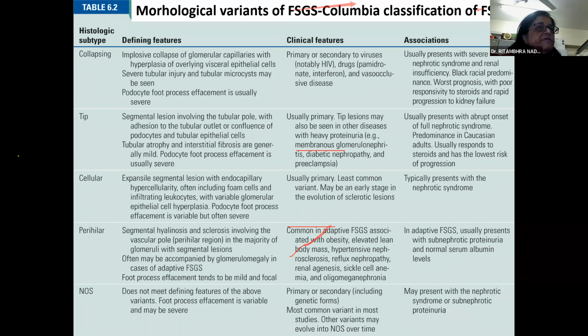So in absence of heavy proteinuria, presence of interstitial foam cells should prompt us to submit the tissue for electron microscopy. And even another morphological clue is that in FSGS secondary to Alport's, the area of fibrosis is generally lateral on the sides of the Bowman space rather than being on tip or in the perihilar region, which looks different from usual FSGS.